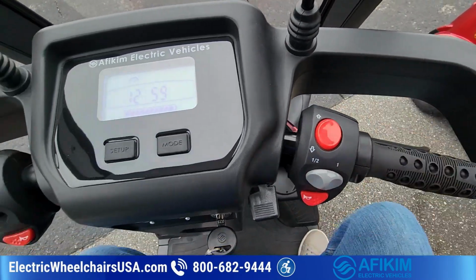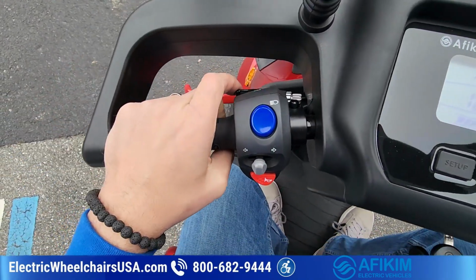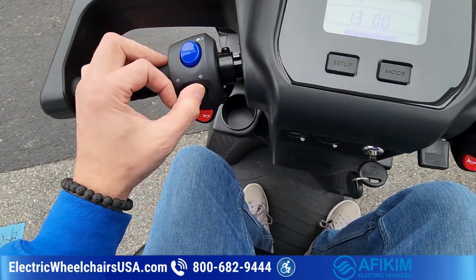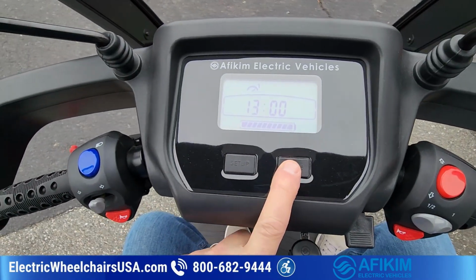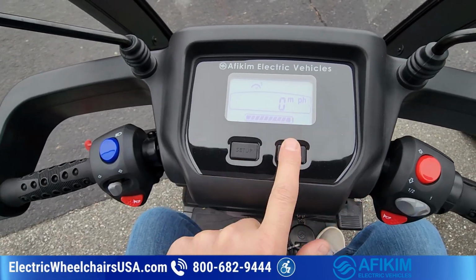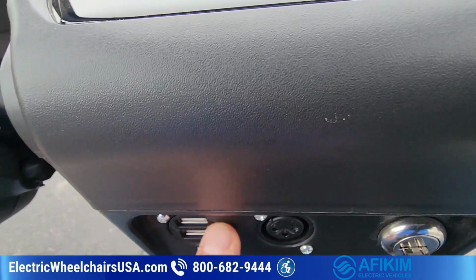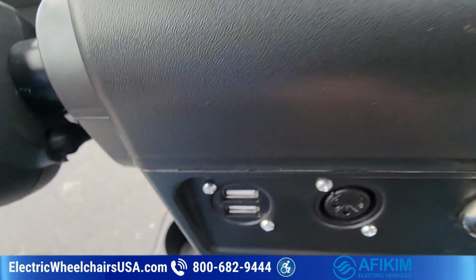You got a horn here, and then on this side you got hazard lights right here. You got your front headlight. You got left and right blinker. And same thing, this is the same setup on that digital dash. So you got the time, which that was in military time. You can change that though. This is speed in miles per hour. Then you got your odometer and then your battery gauge. This also has dual USB charging port. And here's your charging port to charge the actual scooter.